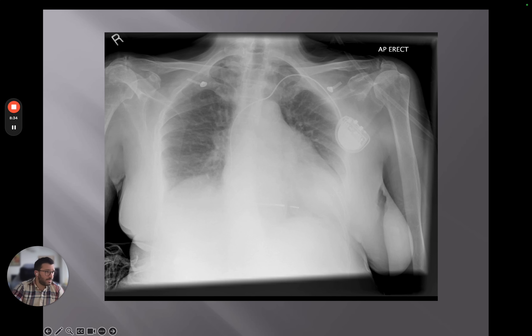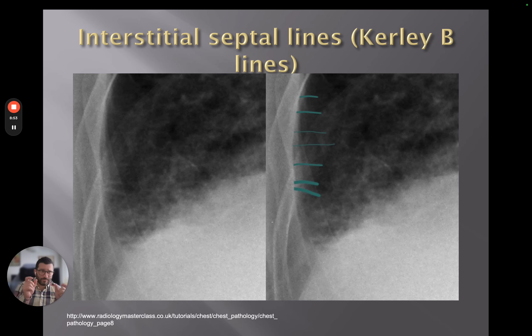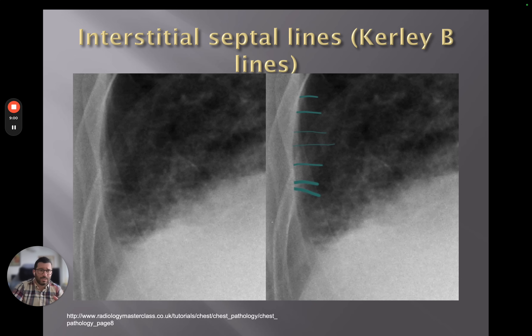We've got slightly more prominent images of these Kerley B lines — these interstitial septal lines — seen within the periphery of the lower zone, usually in the costophrenic angle. Septal lines are caused by thickening of the interlobular septa, which separate the secondary lobules at the periphery of the lung. They can be quite subtle, but if seen in the context of clinical suspicion of cardiac failure, septal lines are a strong indicator of interstitial edema, which can then lead to full-on alveolar edema.